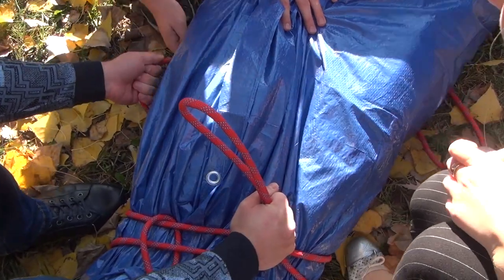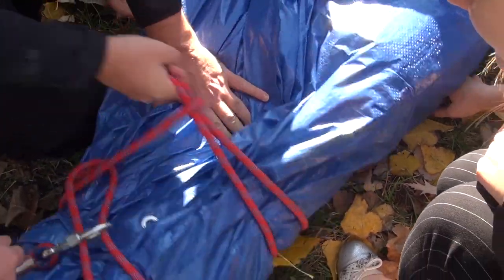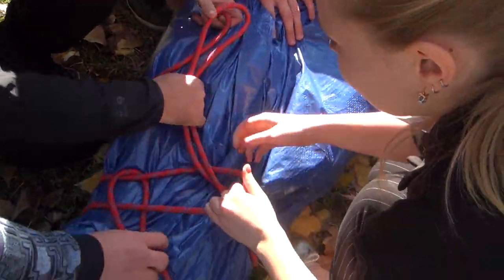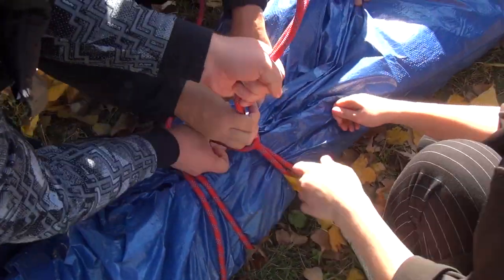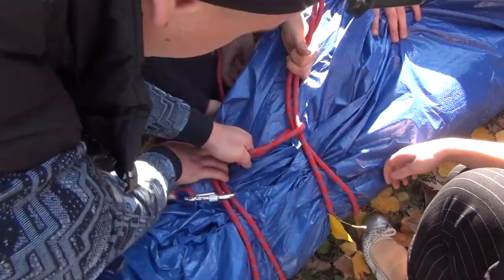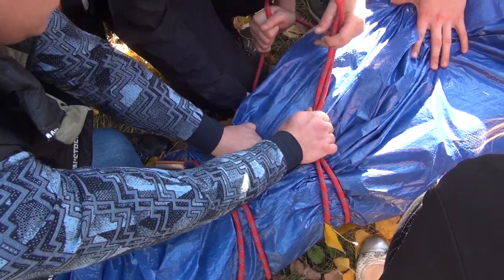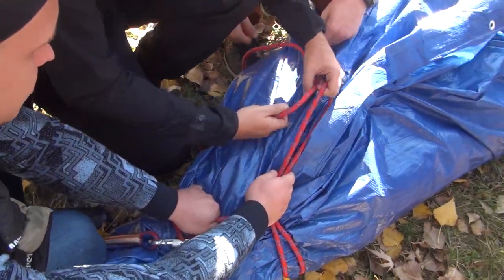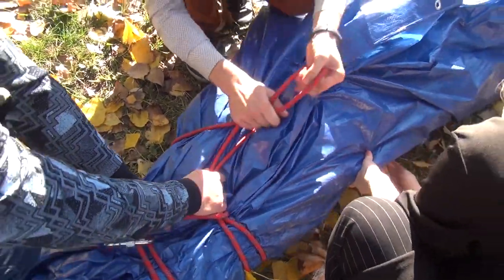Also look here, look. Make sure you tighten it up. Yeah, so you can go here. Because especially with the legs, you don't need much. So you just can go here. Okay, which one do we pull back? Which one is it? Yes, and then you go through. Yes, you take it. Yeah? Cheers. Okay.